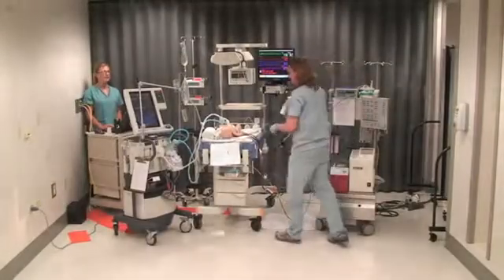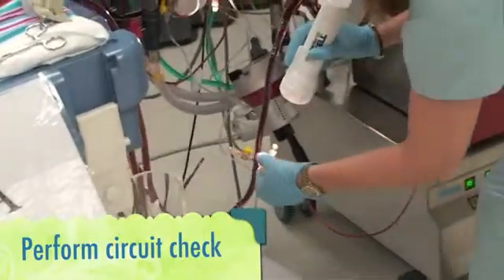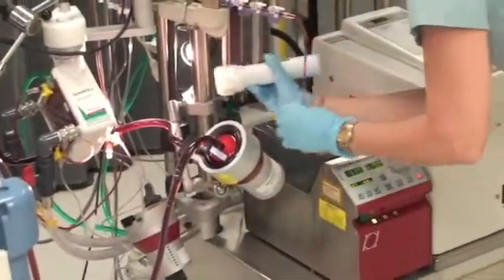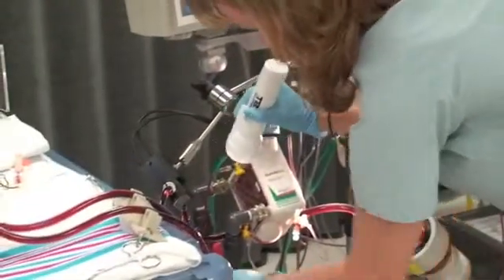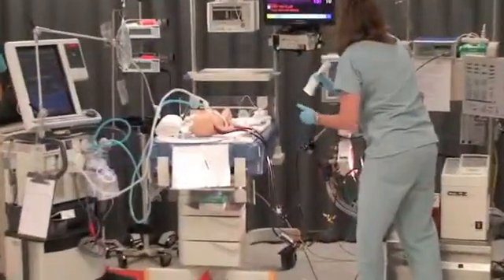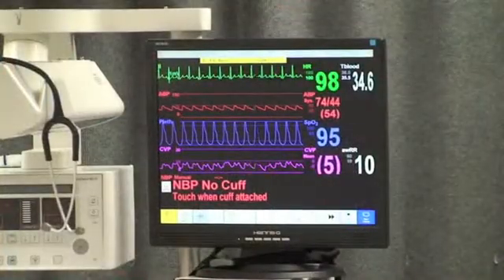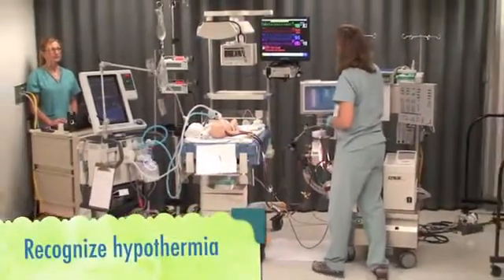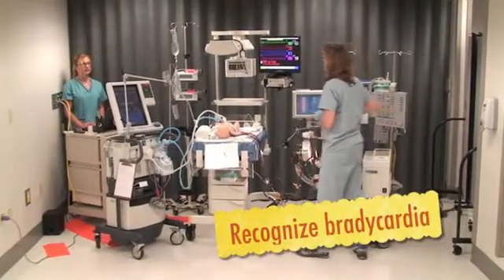I think I'll do a circuit check since I just came back from break. Looks like we have an alarm going off. I see the patient temperature is kind of dropping and the heart rate is dropping as well. We may be getting a little bradycardia and hypothermia.